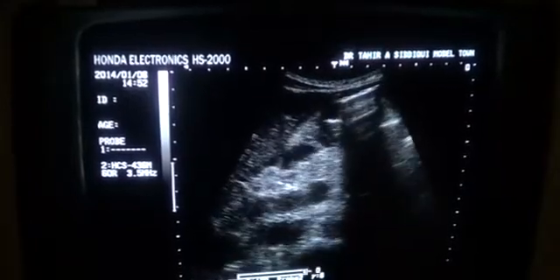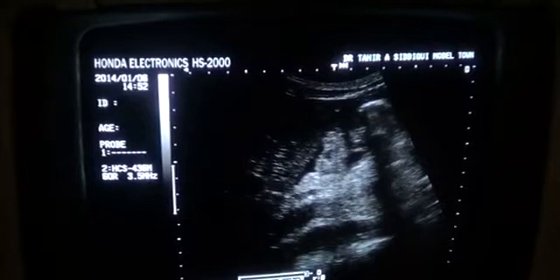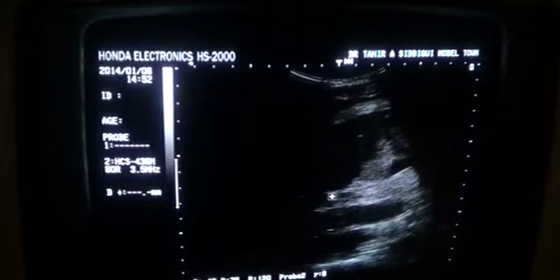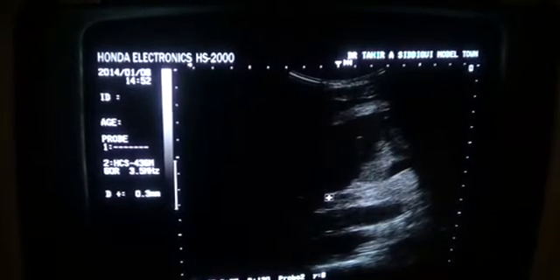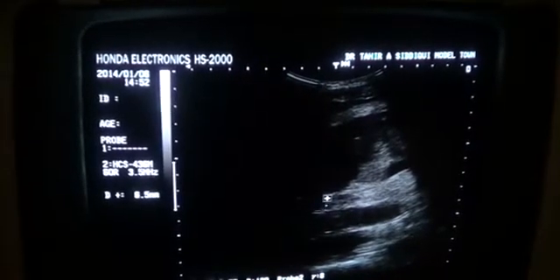Let's see once again. Up to this level, the common bile duct is not dilated. Here you can see the portal vein and the common bile duct. CBD of 6.5 to 7 millimeters is considered to be normal.